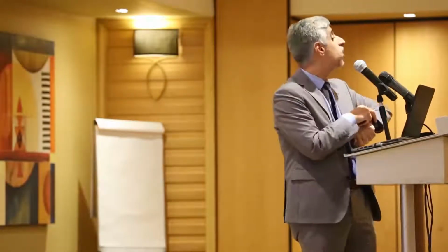For the indications of vertebral imaging, in the Kuwait guidelines we provided indications very similar to the known international ones. We'd like to assess vertebral fractures either by doing the VFA itself, and unfortunately not all hospitals do it. I know Amiri does it, and we're trying to start at Jabbar also. But you can also do a regular thoracic or lumbar spine x-ray if you don't want to do the VFA or your technicians don't know how to do it.